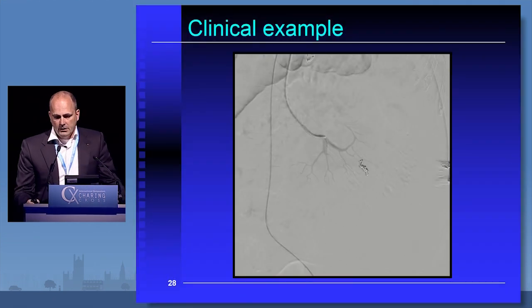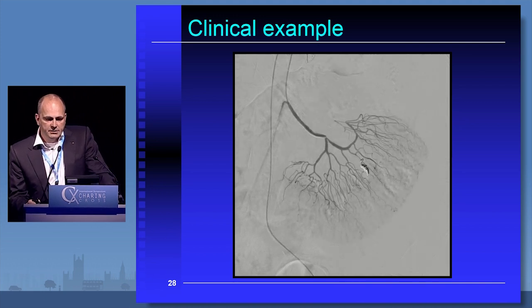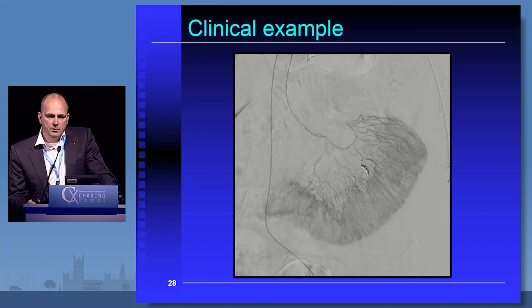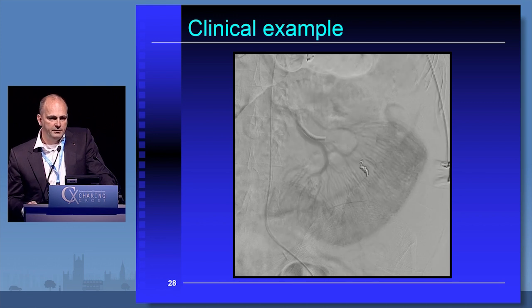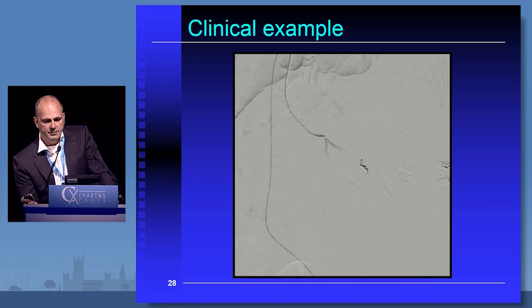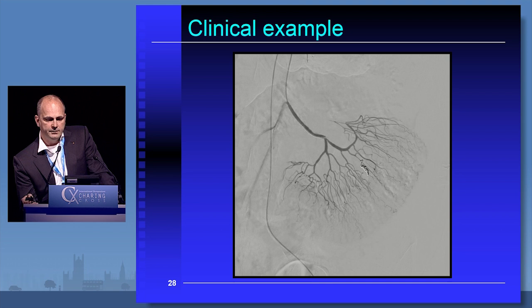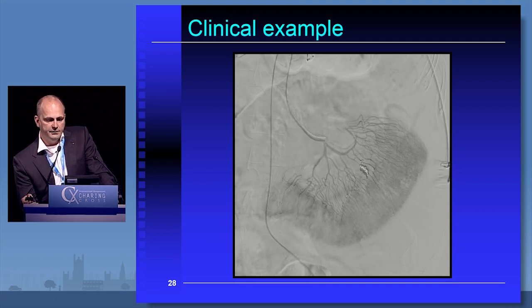A clinical example, if you look at this image, and I first didn't notice, but this is a patient that was in shock, that was actually treated for a gastrointestinal bleed. And as you can see, the patient is moving constantly. The patient is breathing heavily, and still we are able to see all the very fine, detailed vascular structures in this particular set. And these images are very, very challenging. I will replay the same movie again, and you see the moment the patient starts to move, still you can see the very fine arterial structures are well defined.